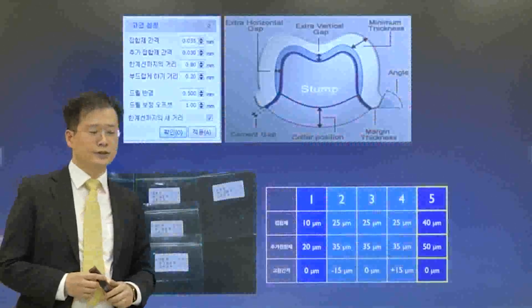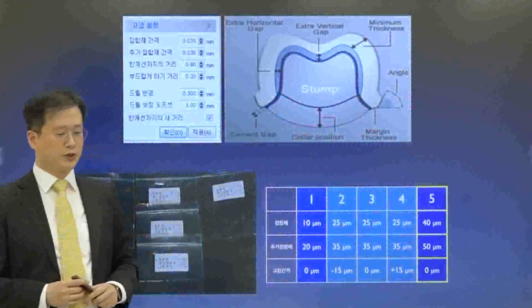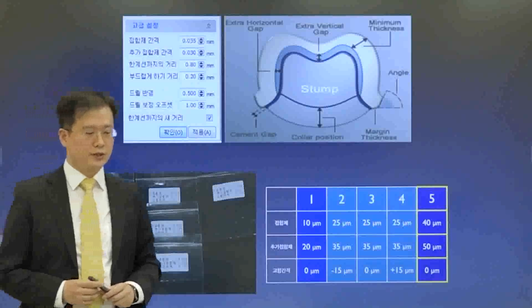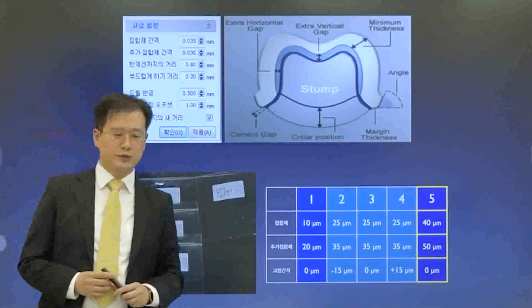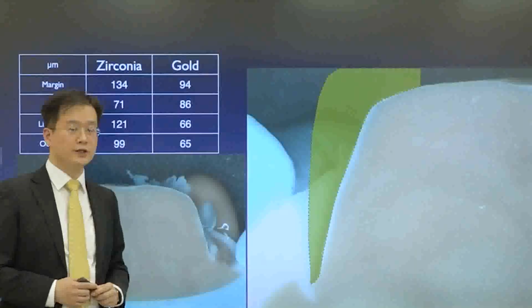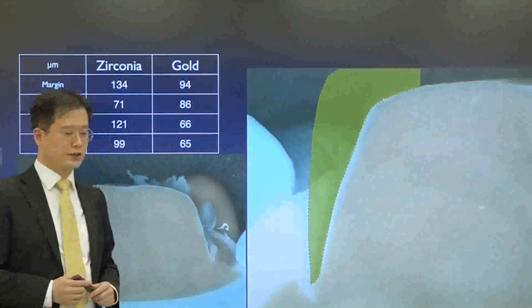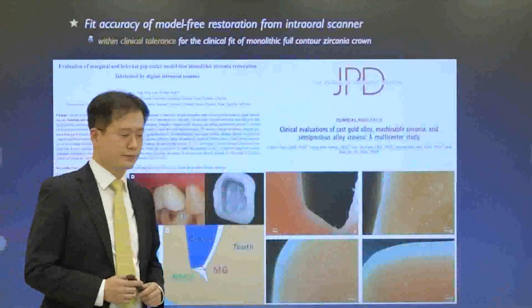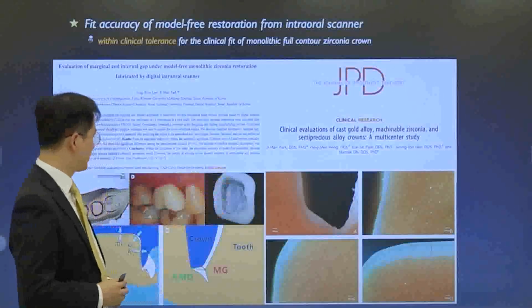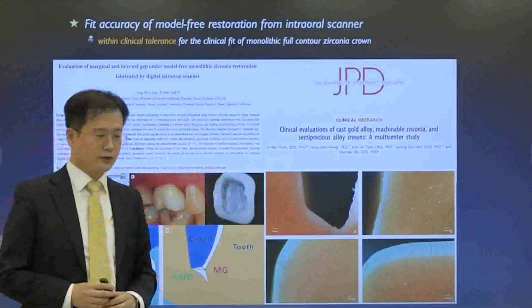At first, the crown is manufactured by changing the inner value parameter of the crown according to the degree of tooth preparation and the abutment inclination, which varies according to the dentist. In clinical practice, the replica technique is used to analyze the internal fit of the crown. It is the shape of how to make a replica from the crowns.